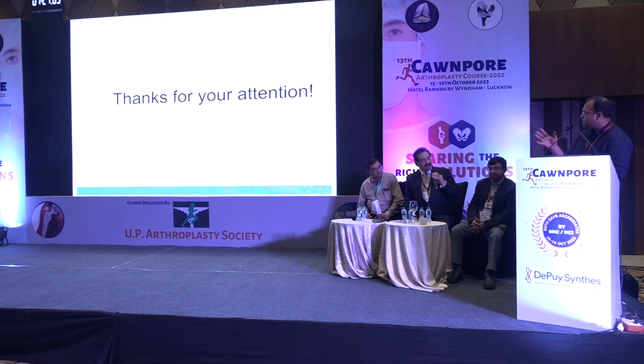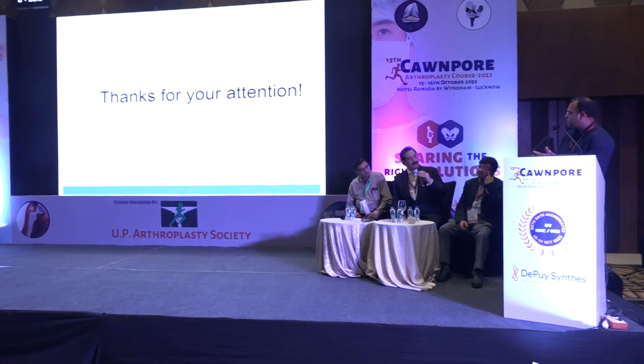So the primary stability, if you see, I had done the reaming part right in the beginning, before even reducing the fracture. The concept of the Solution stem is a distal fixation. So I had a sound distal fixation and knew what the stem size was going to be before I assembled my fracture parts together. I knew how long it had to go in. I could measure the stem diameter and stem length to have a solid fixation, so that when I reconstructed, I did not need to go up and down. That is why I had an exact idea of a 170 mm stem when I had reduced it in the first instance.